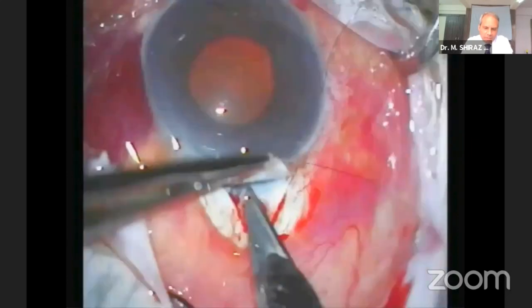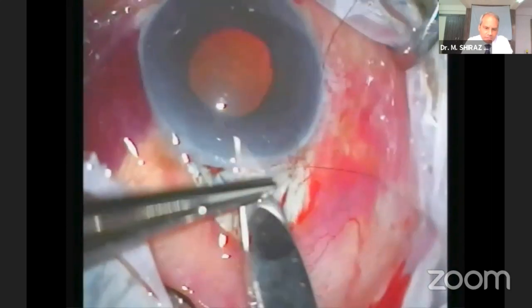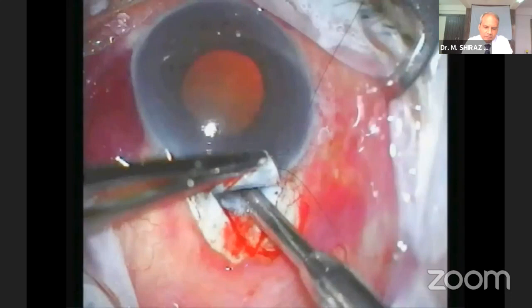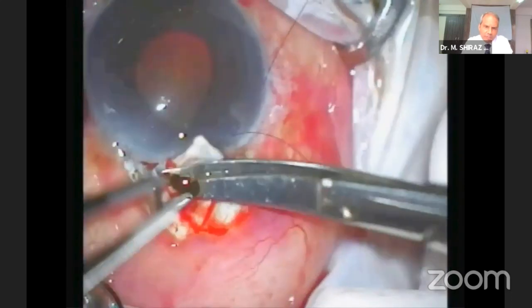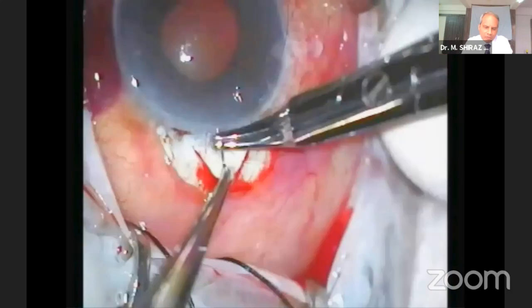The anterior chamber is entered with a number 11 blade. Kelly's Descemet membrane punch is used for sclerostomy. The iridectomy should be made relatively broad at the base but short in length. After iridectomy, the sclerostomy site is washed and balanced with salt solution.